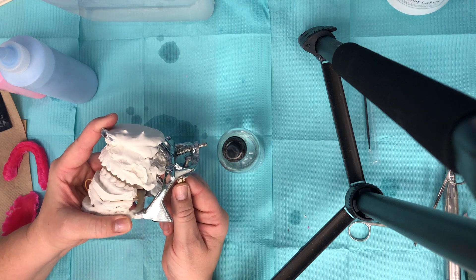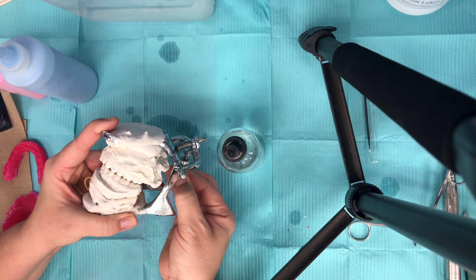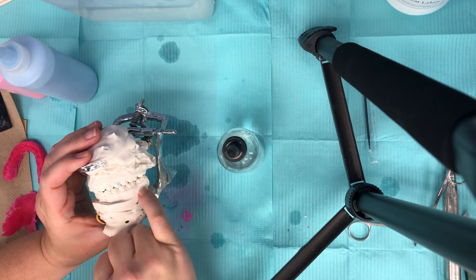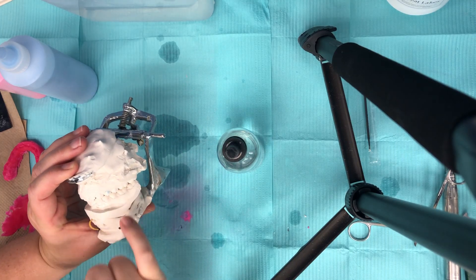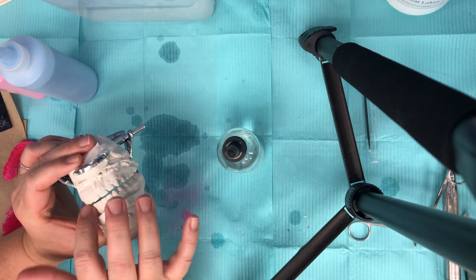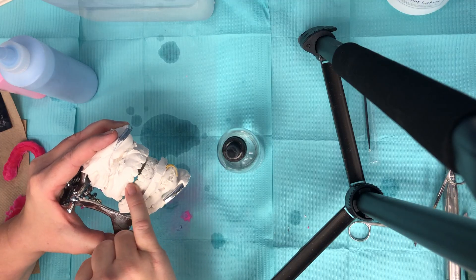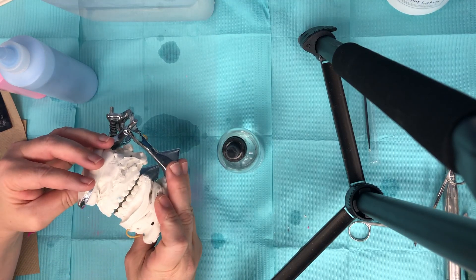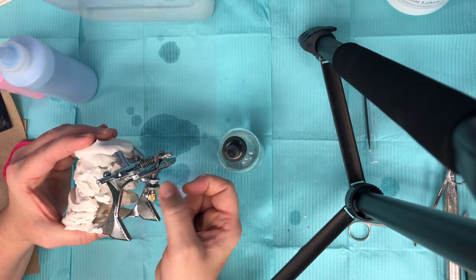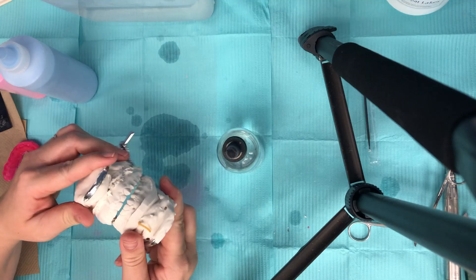For most adults you don't want to make it too thick because then they're not going to want to wear it, especially at work if they need to wear it 24 hours a day, and it won't be easy to sleep in. If we make it as thin as possible, it'll be thinner in the back but thicker up front because we want all of the teeth to touch at the same time — thicker in the anterior and thinner in the posterior. So we're gonna set the pin height by moving this washer up and tightening it so it doesn't go anywhere.